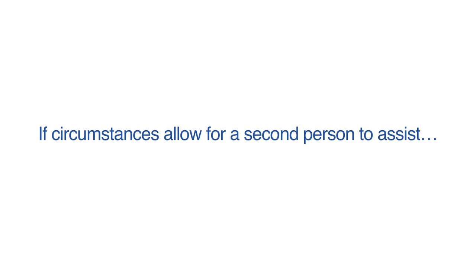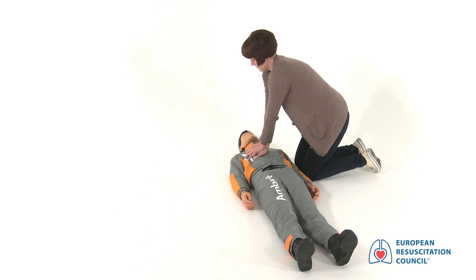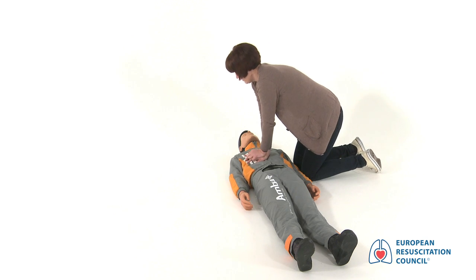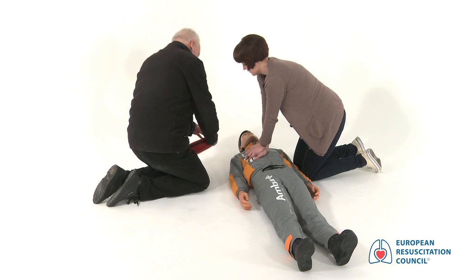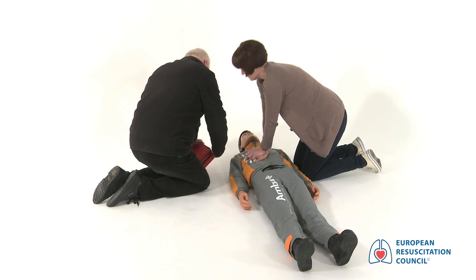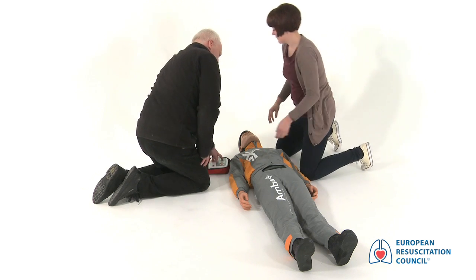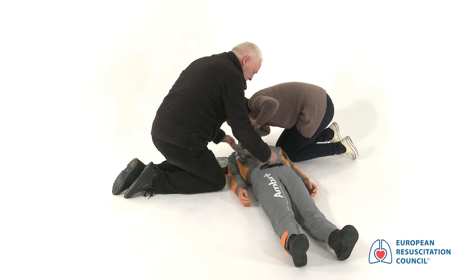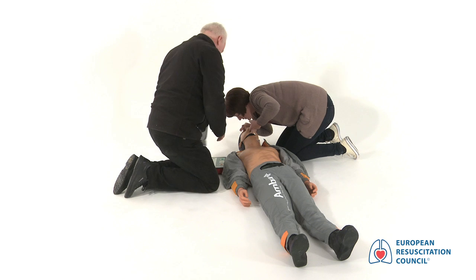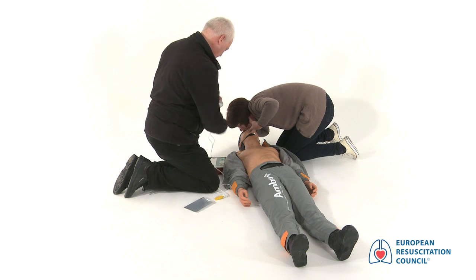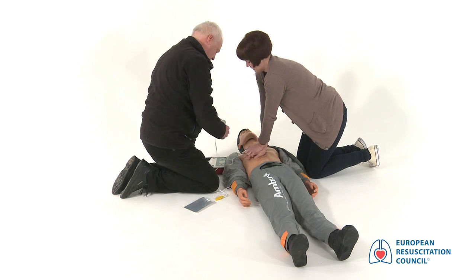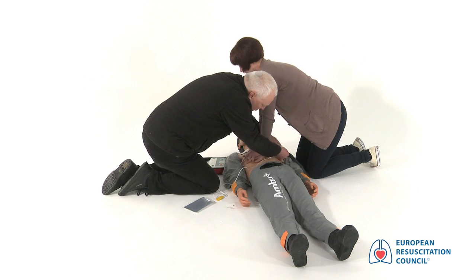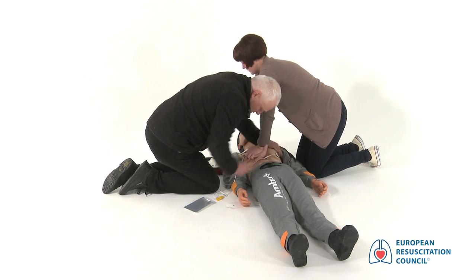If circumstances allow for a second person to assist, then the skills should be split between the two rescuers. The first person should continue CPR until prompted to stop. The second person should operate the AED following the voice prompts given. Apply pads to patient's bare chest. Plug in pads connector next to flashing light.